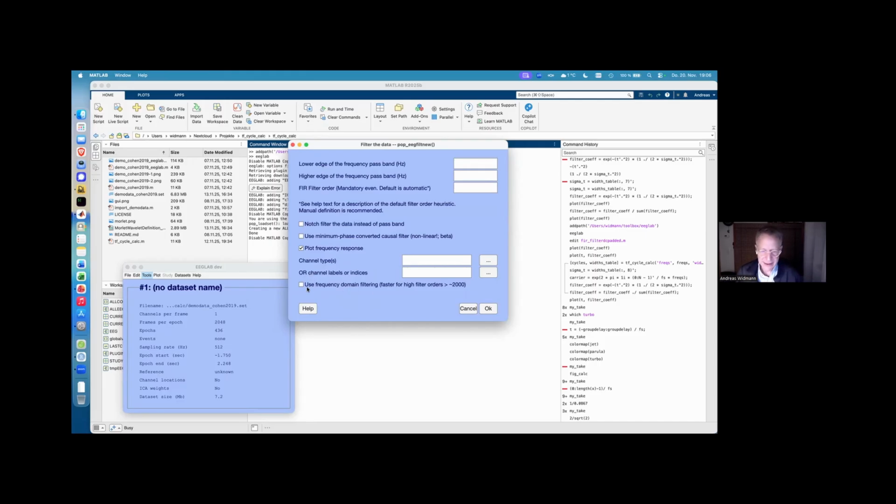So this is time domain and frequency domain filtering. Nowadays frequency domain filtering is faster. Ten years ago, it wasn't, but now with new graphics cards and everything, frequency domain filtering, which can even be FFT-based, can sometimes be faster, but that is only about speed.